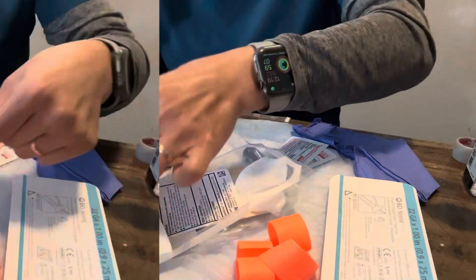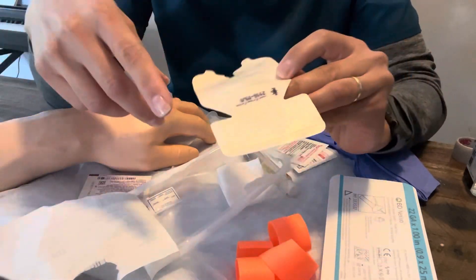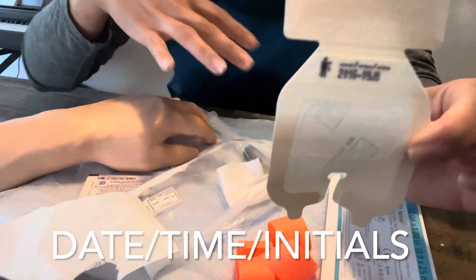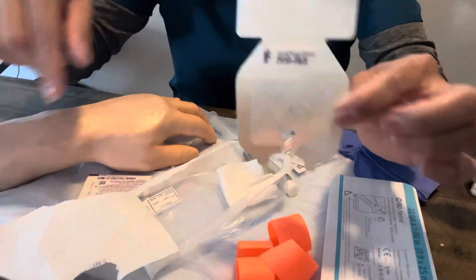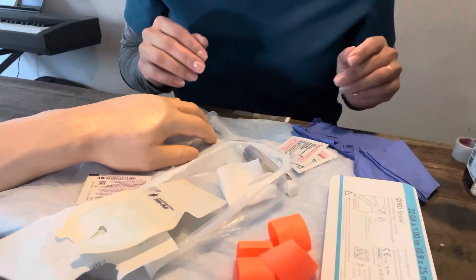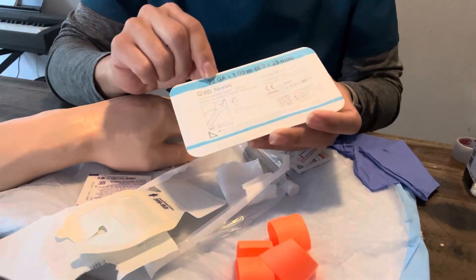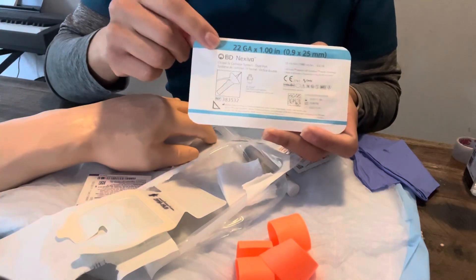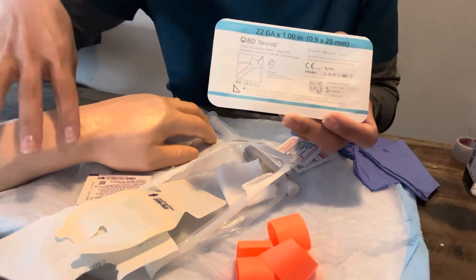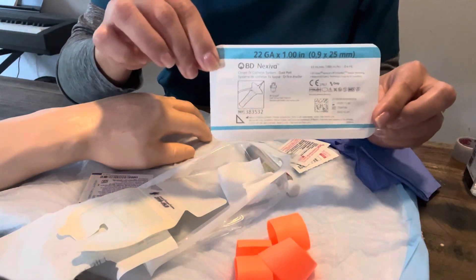This is what I'm going to use to clean. You can write your date, time, and credentials on the Tegaderm prior to applying it to the patient — so once you insert and put your Tegaderm on, the label is already there. You'll also be documenting in the electronic health record. I'm using a 22 gauge one inch. For documentation purposes, once I insert this, this is the patient's left hand, so I'd be inserting a 22 gauge in the left hand.